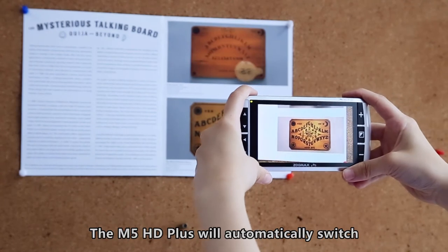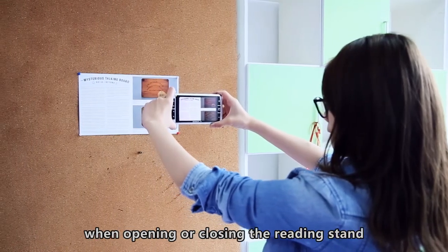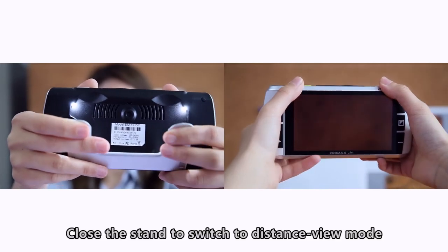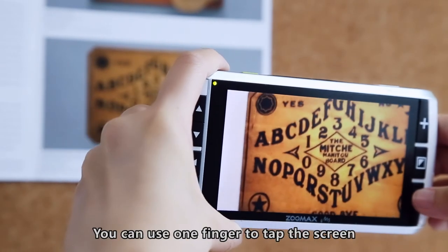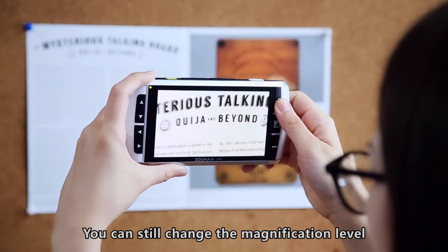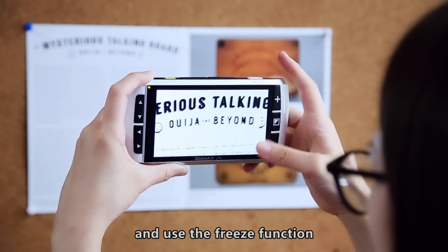The M5HD+ will automatically switch between near and distance view when opening or closing the reading stand. Close the stand to switch to distance view mode. In this mode, the camera is tapped to focus — you can use one finger to tap the screen where you want to focus. You can still change the magnification level, color mode, and use the Freeze function.